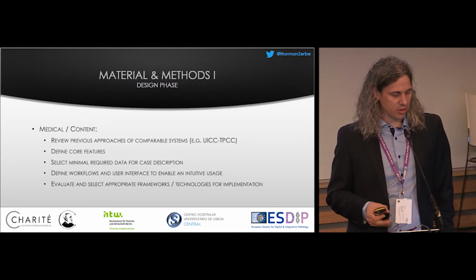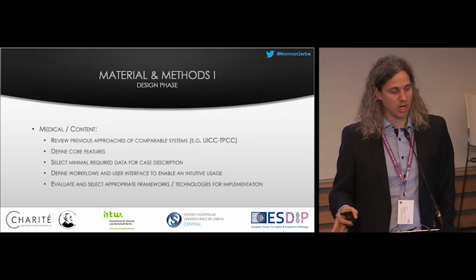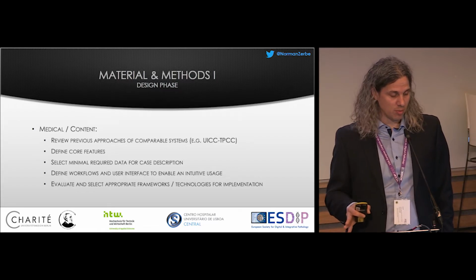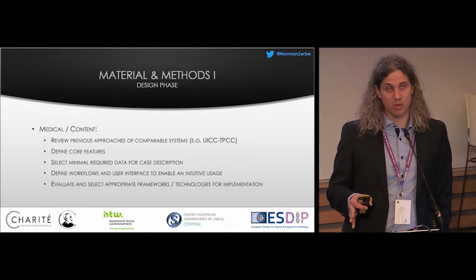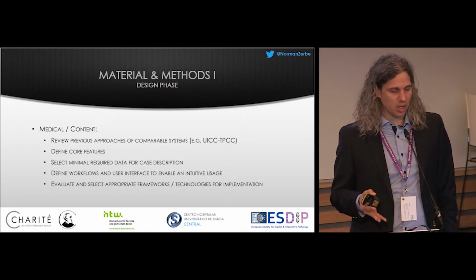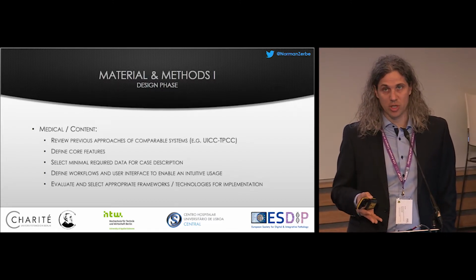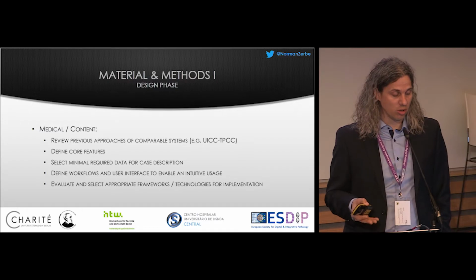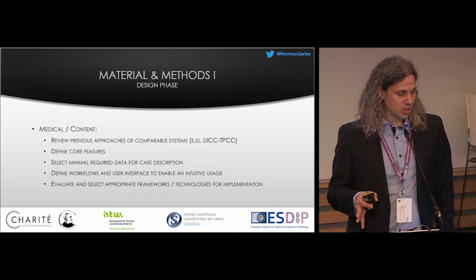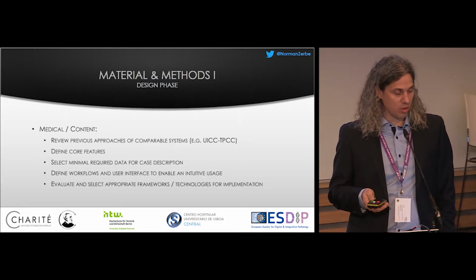What we then did is that we first, of course, reviewed what was there in the past. Some of you might have seen systems like UICC TPCC, which more or less died 10 years ago because of several problems. It's just an example. Mainly the problem of those platforms was that they were not intuitive enough, access was too complicated, and it was too time-consuming to put your cases in there. You had to wait too long to get answers, and that's why those systems died. So we tried to address those problems and created a very intuitive and short workflow to define your case and to illustrate your case.